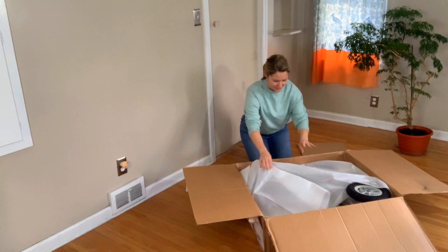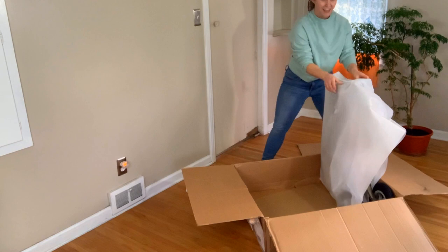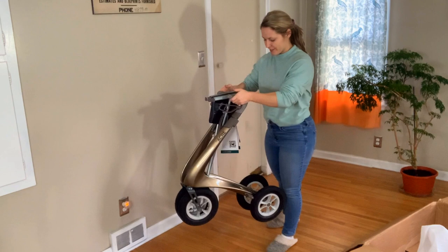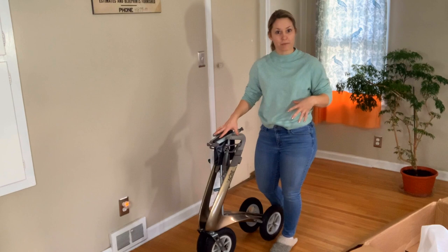Oh my gosh — so it looks like it is already ready to go. There's nothing I need to do other than take it out. Oh my goodness, I am obsessed with this color. So as you can see, this is still pretty light. I was a little nervous it would be heavier because the Carbon Ultralight is so light. This is advertised as a rollator you can bring out on all terrains and it drives smoothly. So I thought it'd be heavier, but it's not — nice and lightweight.